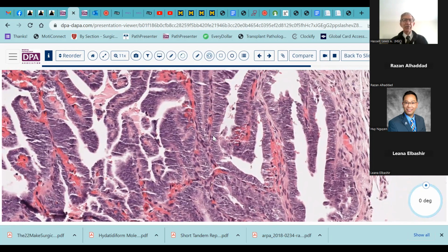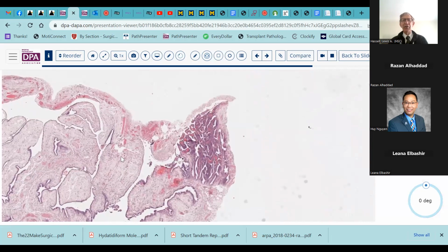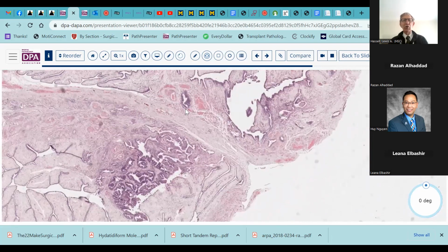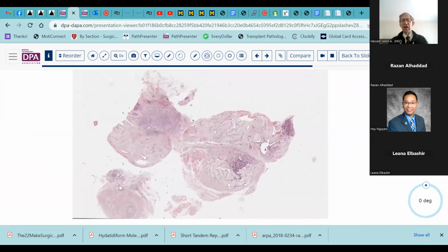And this is one of the challenges of this disease: it's different than many, many other cancers in that regard. And so the therapies that are directed towards it and the way we stage it are based on that altered histology, altered biology of spread that we see with serous carcinoma. So those are a couple of nice examples of serous tubal intraepithelial neoplasia carcinoma, both in the more florid example as well as earlier in that very, very subtle case.